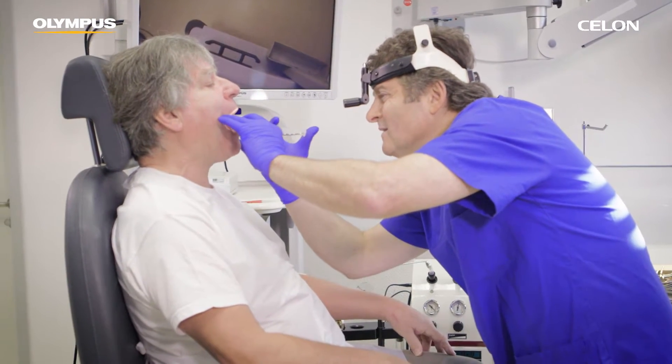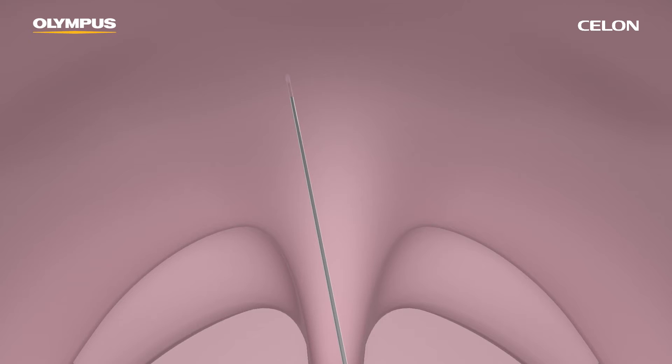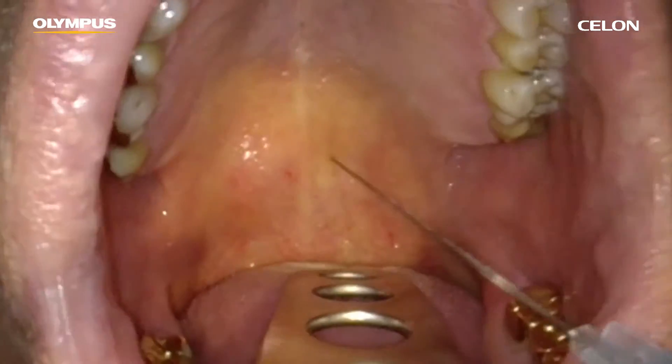For local anesthesia, the injection of 0.5 milliliters of a 2% lidocaine solution is recommended at two points paramedially below the border between the hard and soft palates.